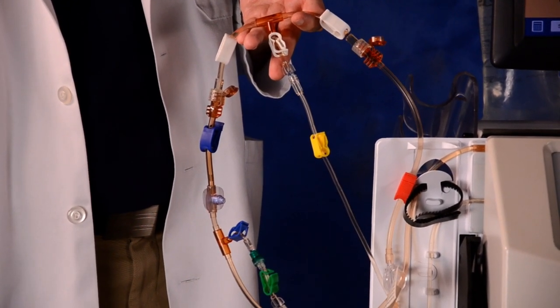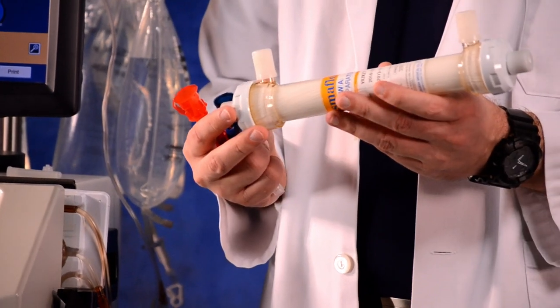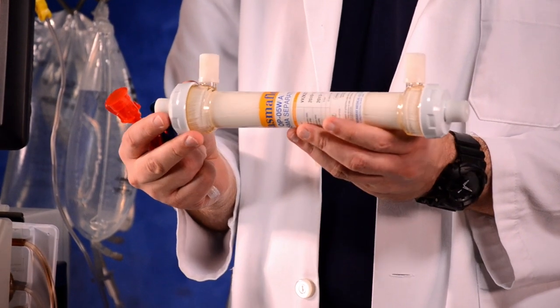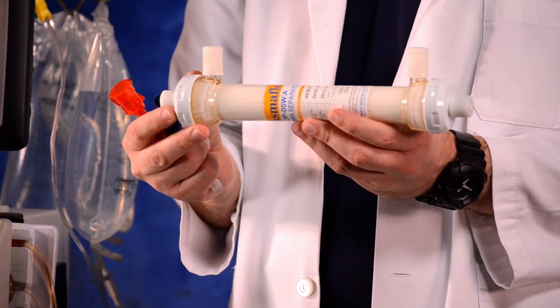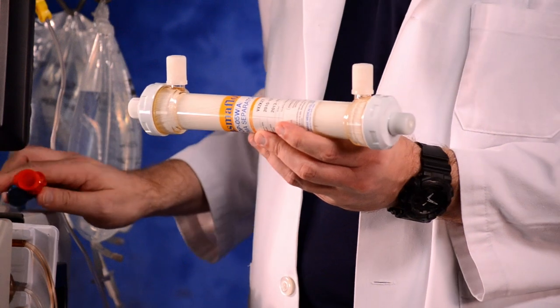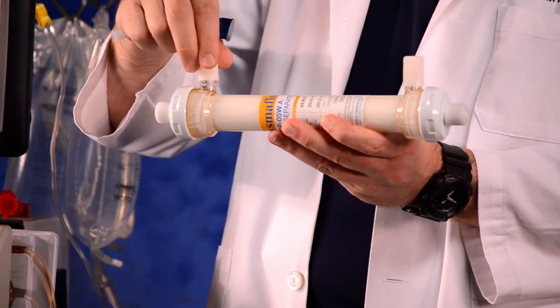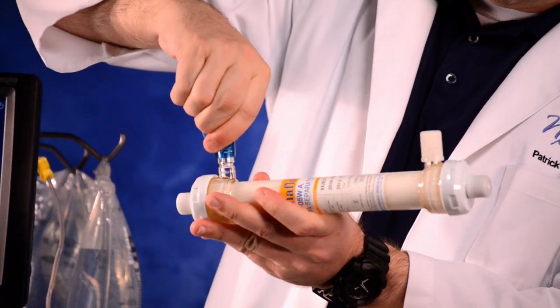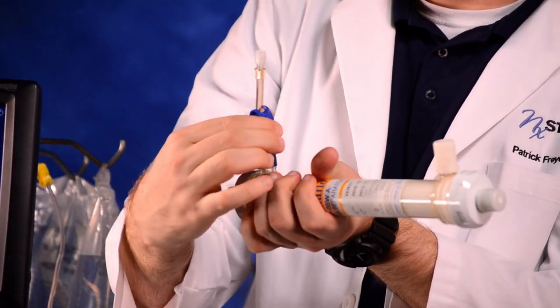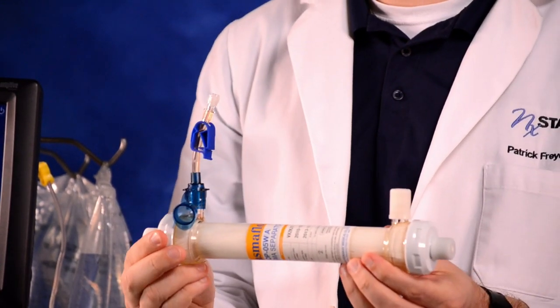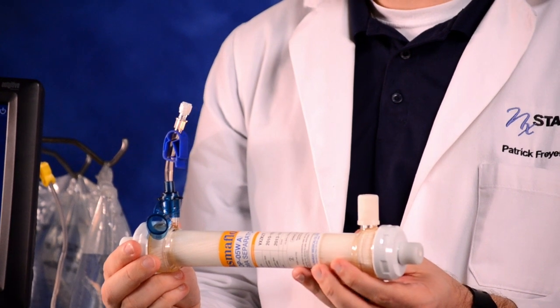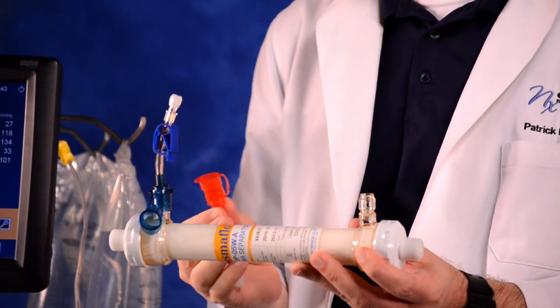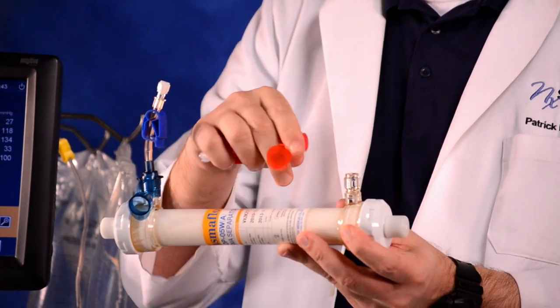You are now ready to attach the plasma separator. Remove the plasma separator from its package. Hold the filter so you can read the labeling. Turn the filter so that the side ports are upright. Remove the cap from the plasma outlet top side port. Attach the blue Hansen connector and clamp. Seat fully to prevent leaks. Continue holding the filter so that the side port is upright and remove the cap from the remaining outlet bottom side port. Attach the red Hansen connector, seat fully, and clamp.